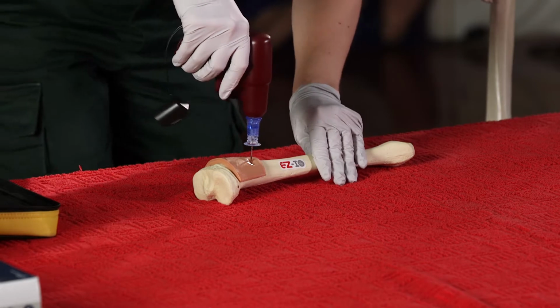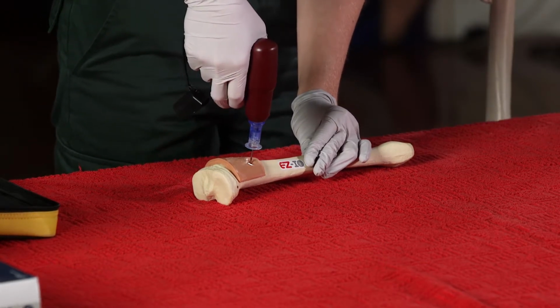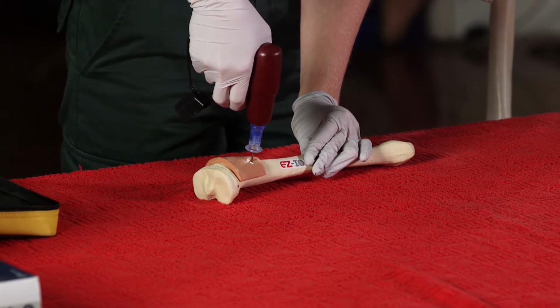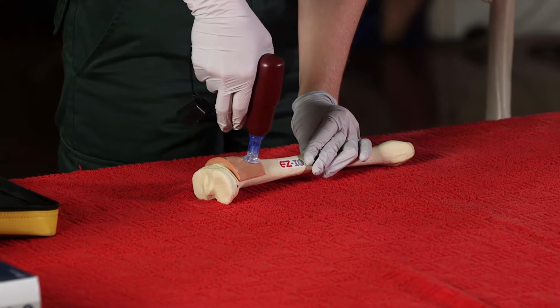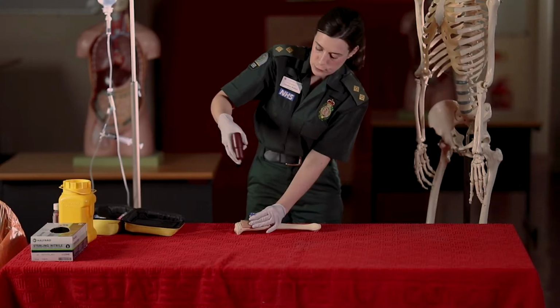Being satisfied that there's at least one of those black lines there, I'm then going to drill in a smooth fashion until I feel a give. And I can remove my drill.